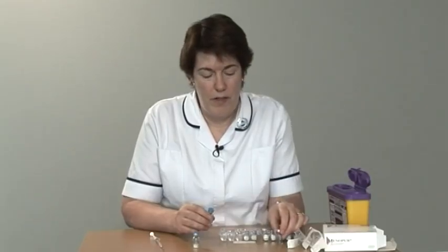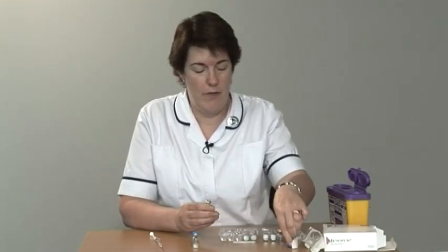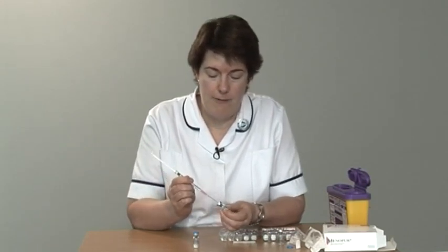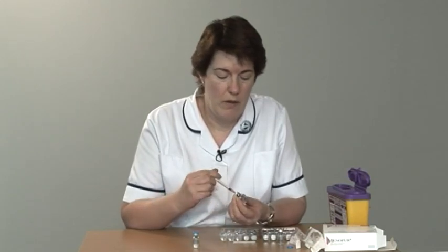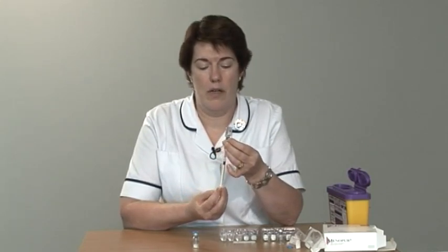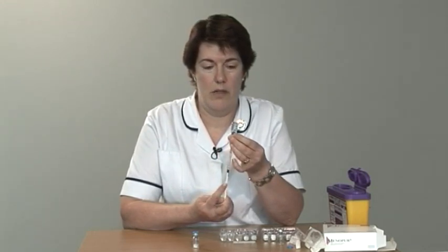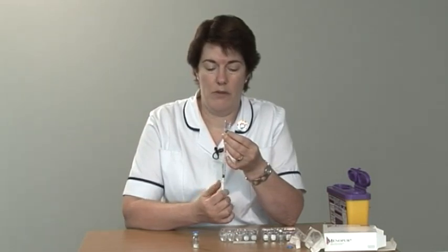Once you've drawn up the first 75 units, flip the top of your second vial of powder, insert the needle again into the centre of the rubber bung, squirt your 1 ml of liquid into the vial of powder. Again, it should dissolve immediately. Invert the vial and slowly suck up the mixed liquid. You should now have 150 units in 1 ml of diluent.